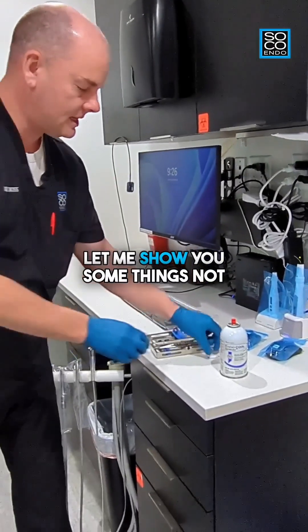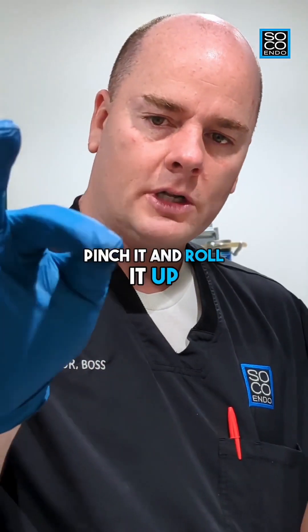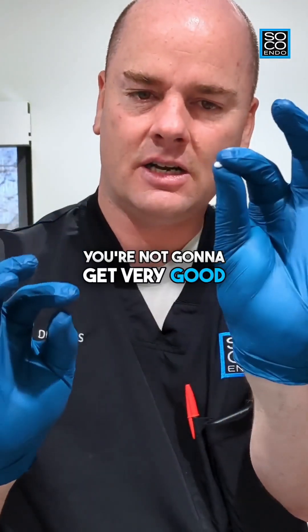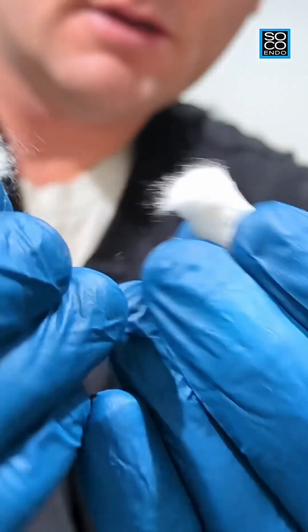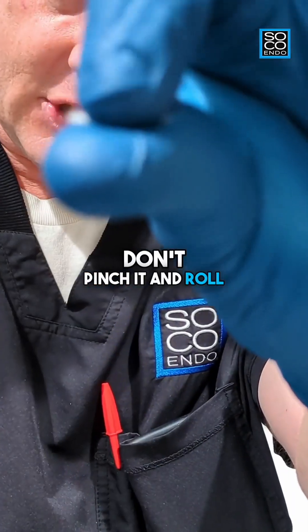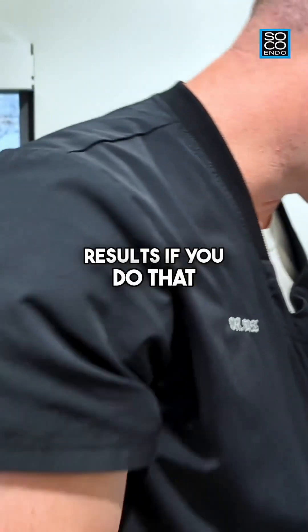Let me show you some things not to do. As you get that loose cotton from the center of the cotton roll, don't immediately pinch it and roll it up into a string and then make a cotton pellet out of it — you're not going to get very good results if you do that.